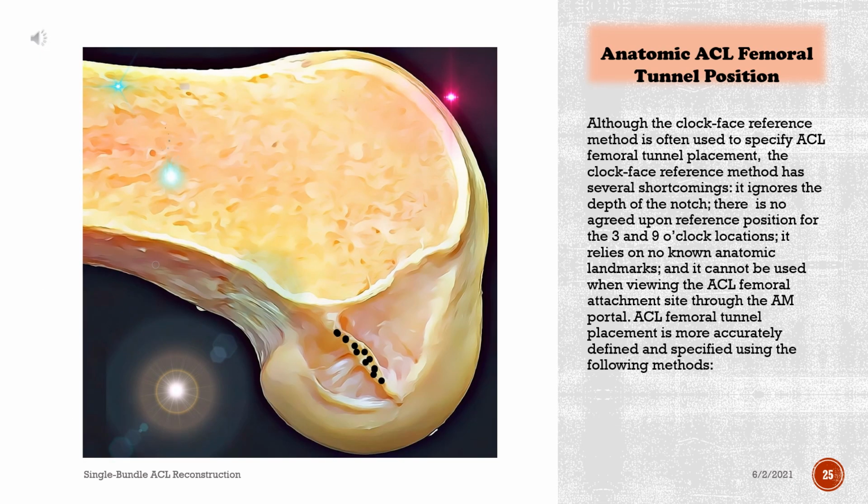Anatomic ACL femoral tunnel position. Although the clock face reference method is often used to specify ACL femoral tunnel placement, the clock face reference method has several shortcomings. It ignores the depth of the notch.